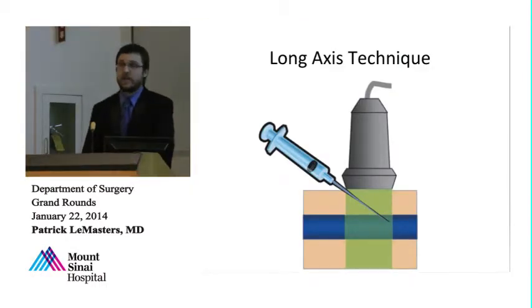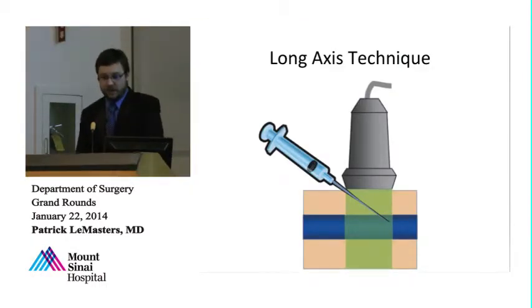Yep, there's the long axis technique. This is another technique for puncture. It's called long axis or longitudinal axis approach. And this is done by placing the needle parallel to the probe. And this one has actually been associated with being better able to visualize the whole needle along its entire course. And there's actually been recent literature saying that this may actually increase first pass success.